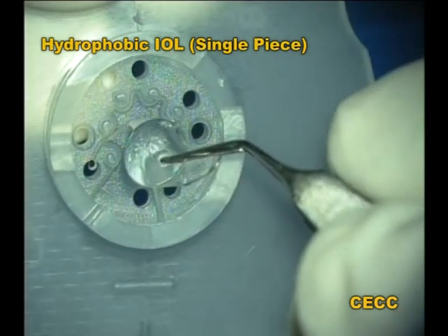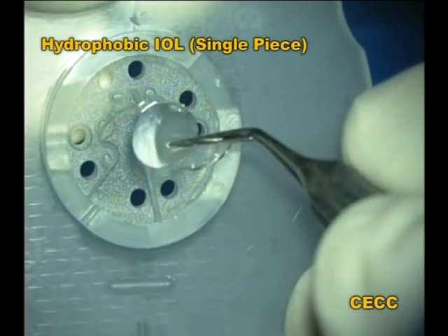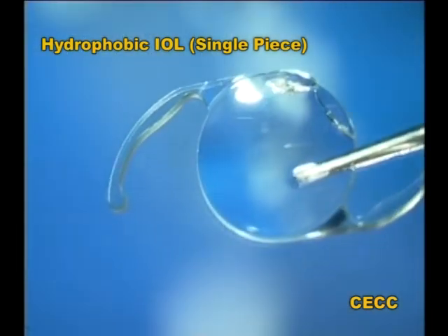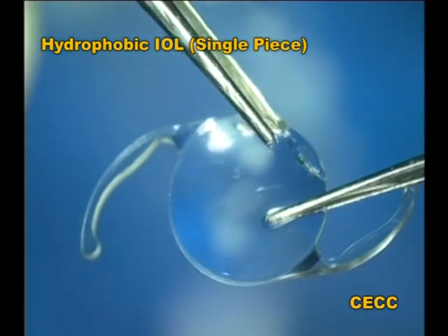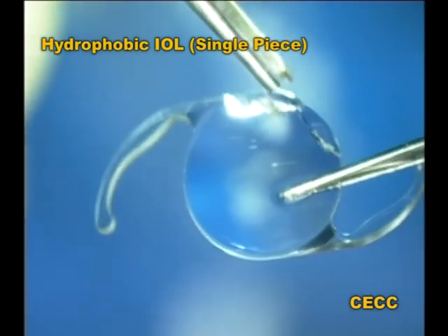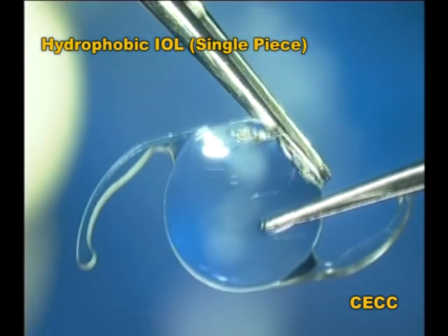This is a single-piece hydrophobic acrylic intraocular lens with a defective optic. Lenses from reputed companies also should come under strict scrutiny. It is extremely important for us to carefully inspect the IOL and the insertion system prior to getting the lens ready for implantation.